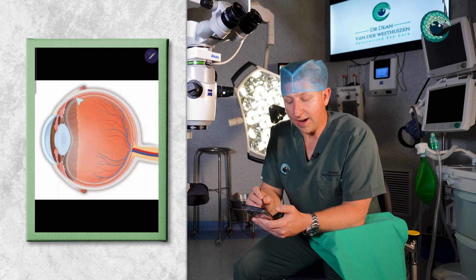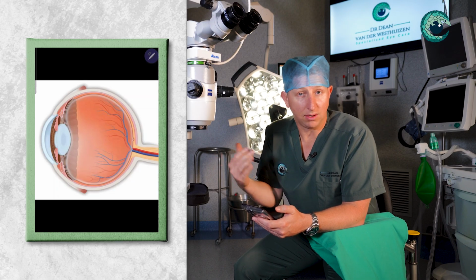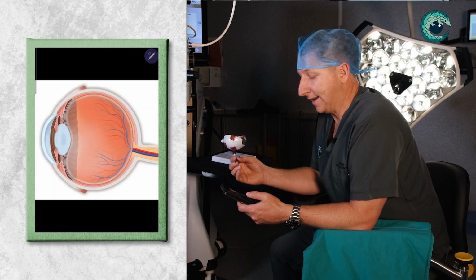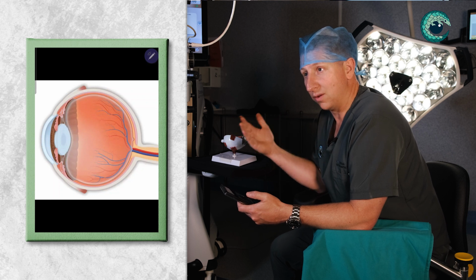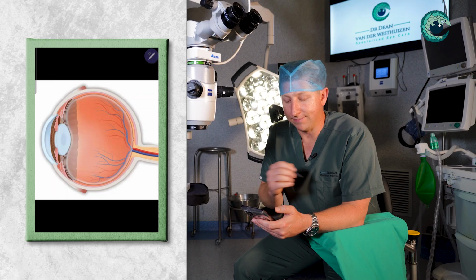We also cannot access it from the retina. If we put instruments through this part of the eye, we would go through the retina. Going through the retina would cause a tear and damage and a retinal detachment, and that would also need to be repaired. And so we access it through this small area called the pars plana, and hence the name pars plana vitrectomy. All our instruments are placed through this area called the pars plana.